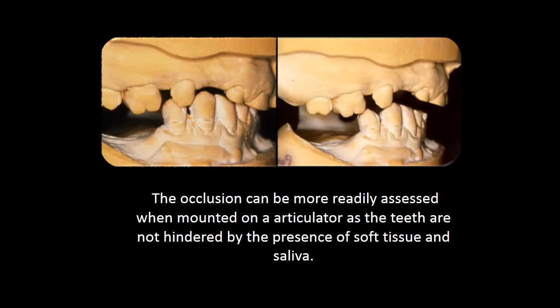For cases of complete denture and removable partial denture without stable occlusion, we record the jaw registration using centric relation. Both the pictures above are the same set of casts, but the first is mounted in intercuspal position and the other is in centric relation. In centric relation, we can see that there is space to restore the anterior teeth.